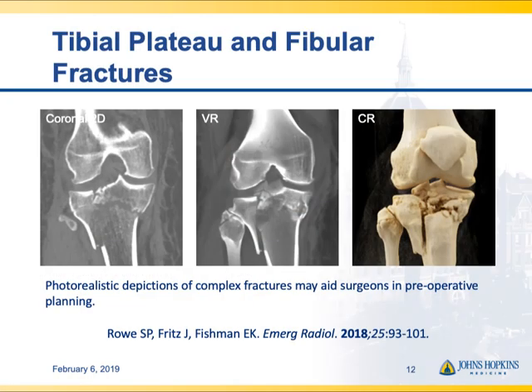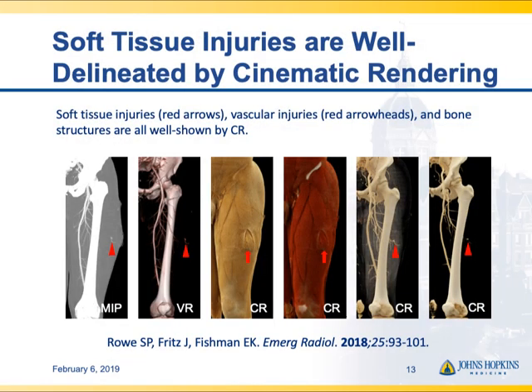Here's an example of a Schatzker type 6 fracture of the tibial plateau. Volume rendering certainly shows this is an extensively comminuted fracture with numerous fragments, but with the shadows that create a sense of where each object is relative to others, you get a much better sense of the fracture in the cinematic rendered image.